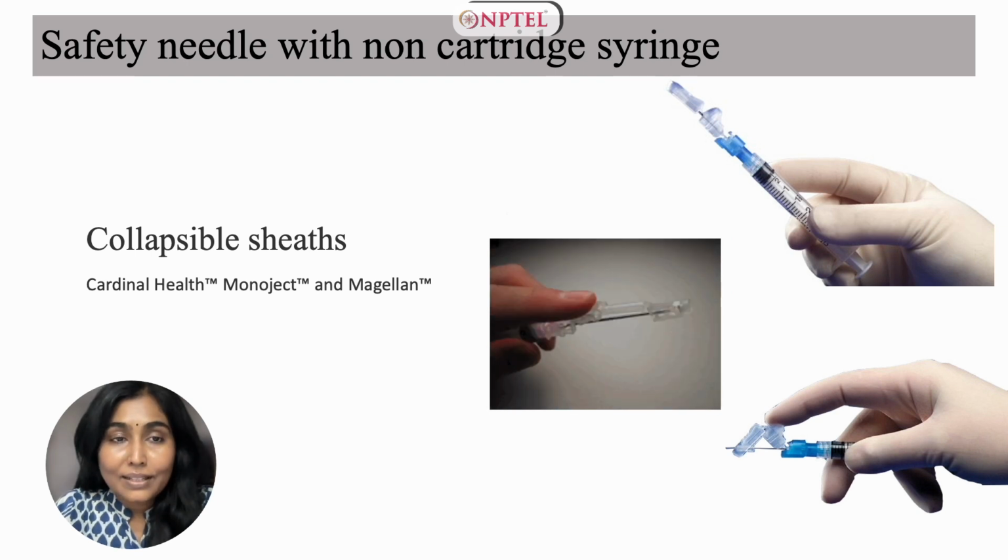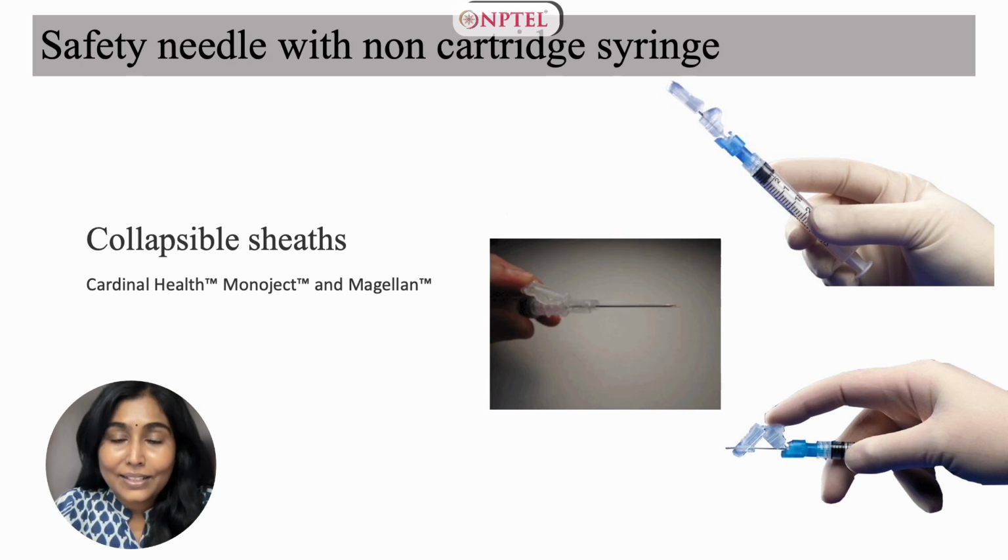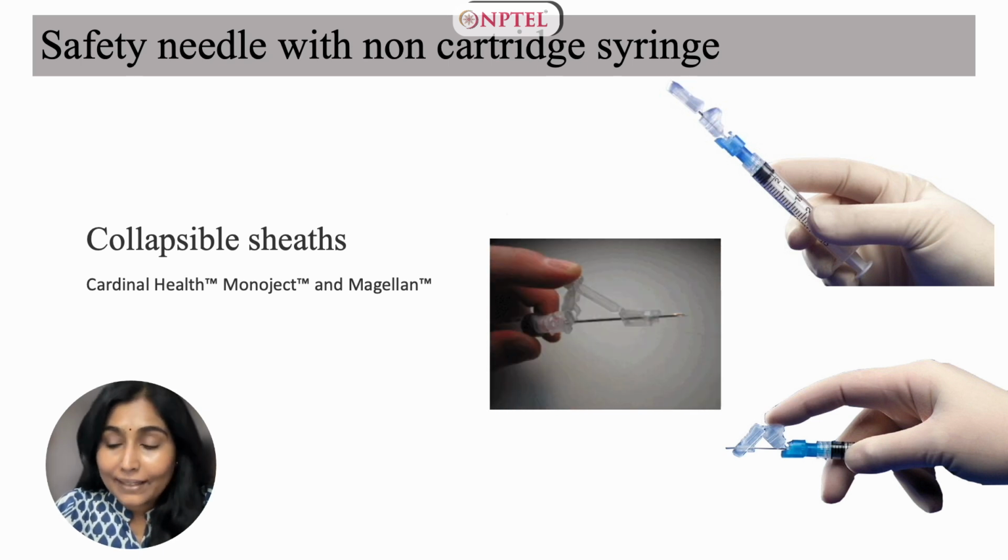Another novelty in safety needles is the incorporation of a collapsible sheath over the needle. This is much more comfortable than the other types.